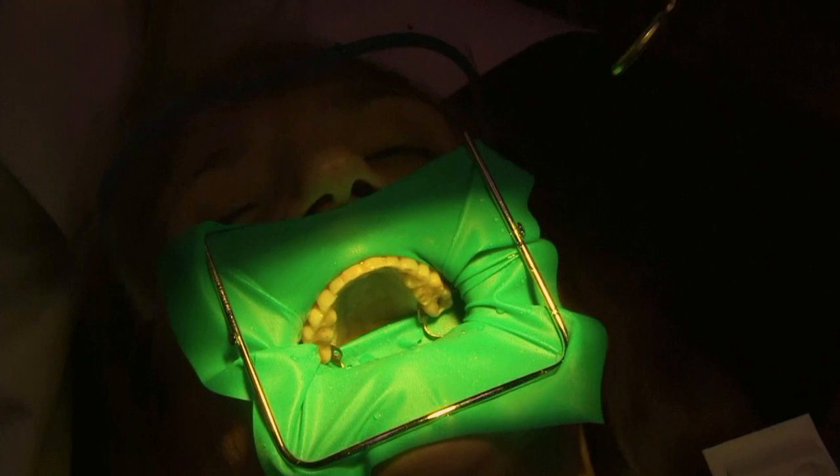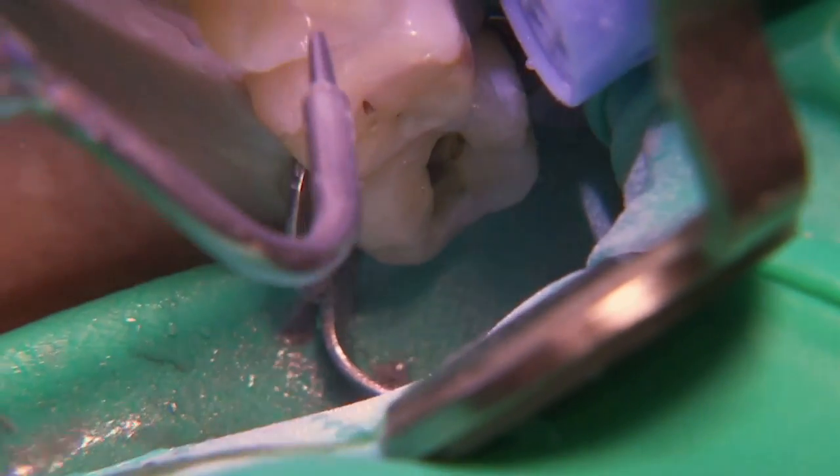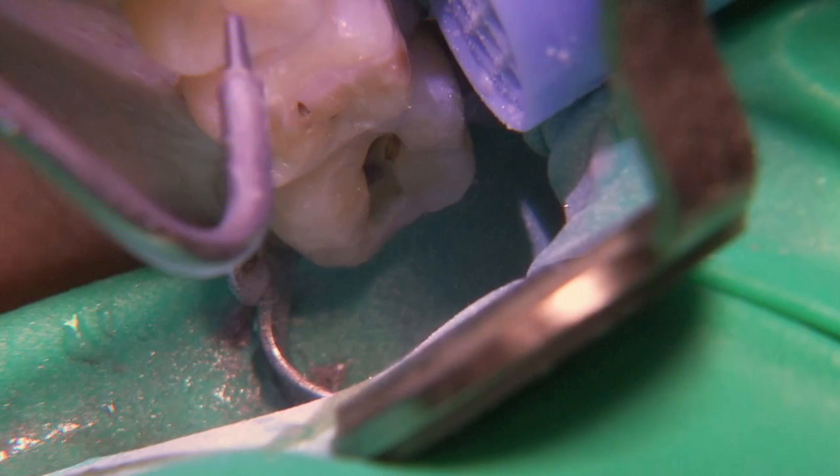The way I would structure this appointment is to start by putting a rubber dam on and bonding in my resin toppers on the back teeth. Any small fillings would be removed and the whole occlusal surface would be air abraded.